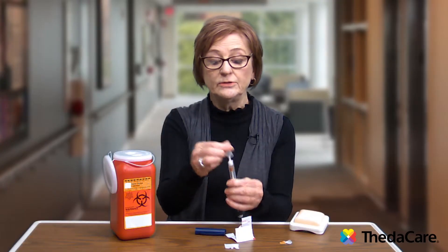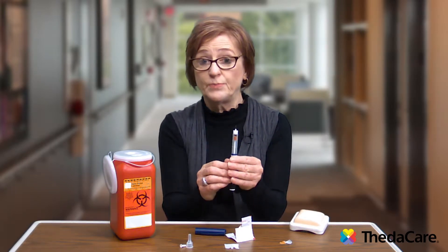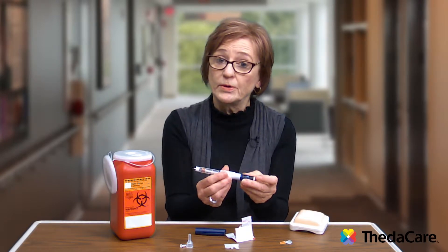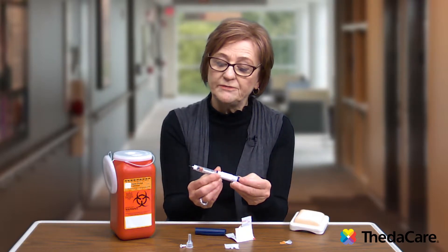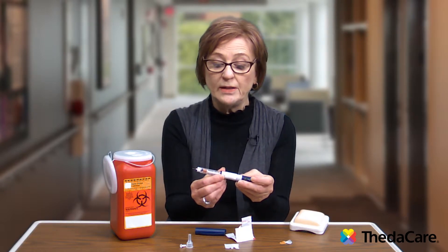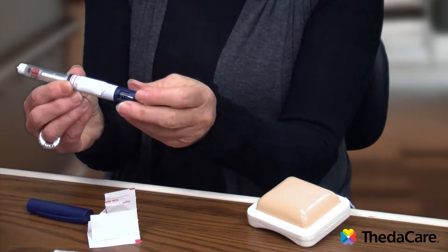Then take off the outer cap, and there's also an inner cap — make sure that you take off both caps to expose the needle. The next step is very important: it's called a safety test or an air shot, which basically gets rid of any air that might be in the cartridge, as well as any air in the new insulin needle that you put on the end.